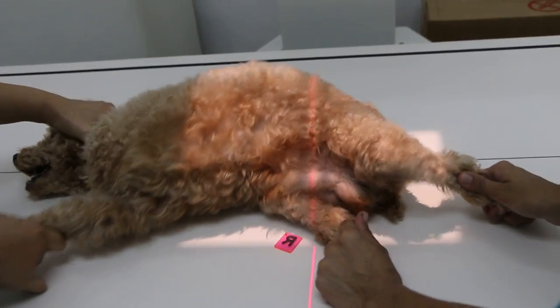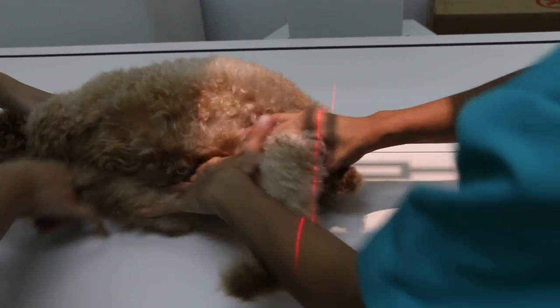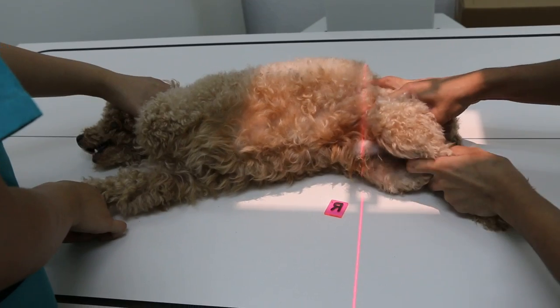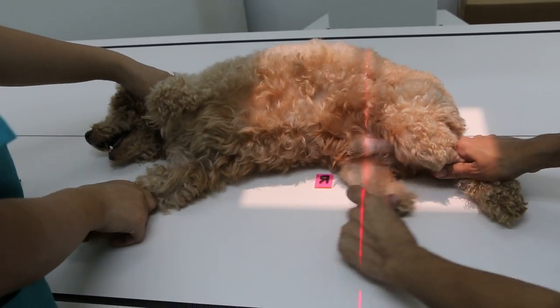So focus will be on what? On the hip, right? Yes. Okay, this is just a demonstration only — it's not the actual X-ray, just a demonstration. Okay, thank you.